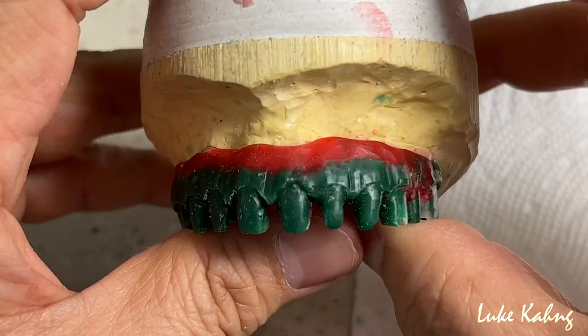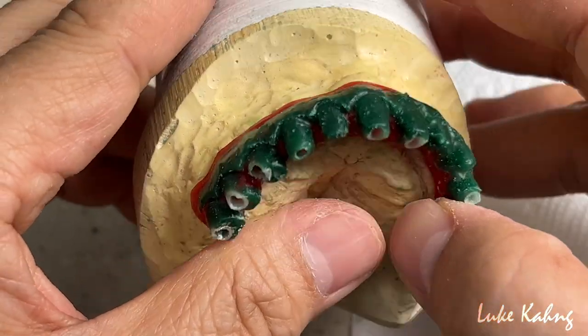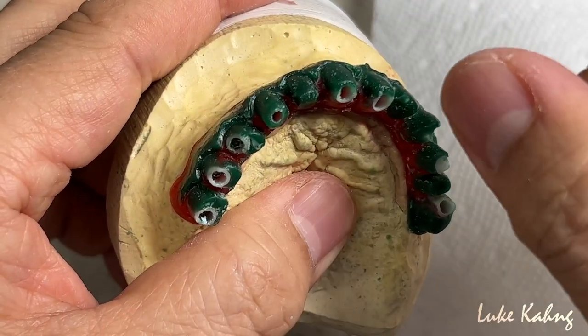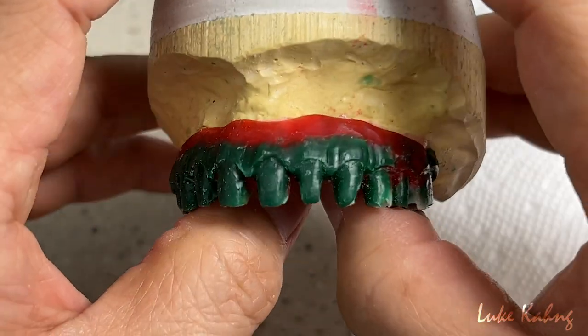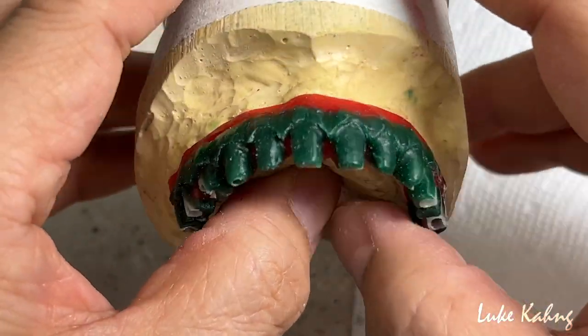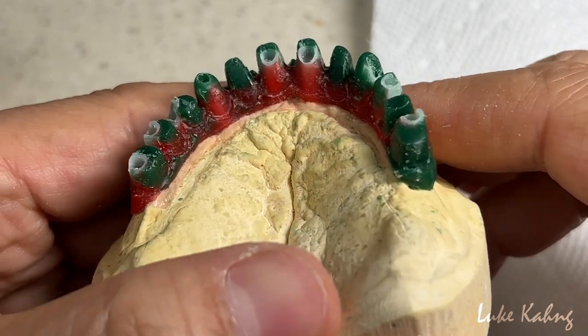You can reference my previous videos on my YouTube channel — we showed many UCLA-type cases with full wax-up and contouring there, so I'm not repeating the whole process here since it would be duplicated.